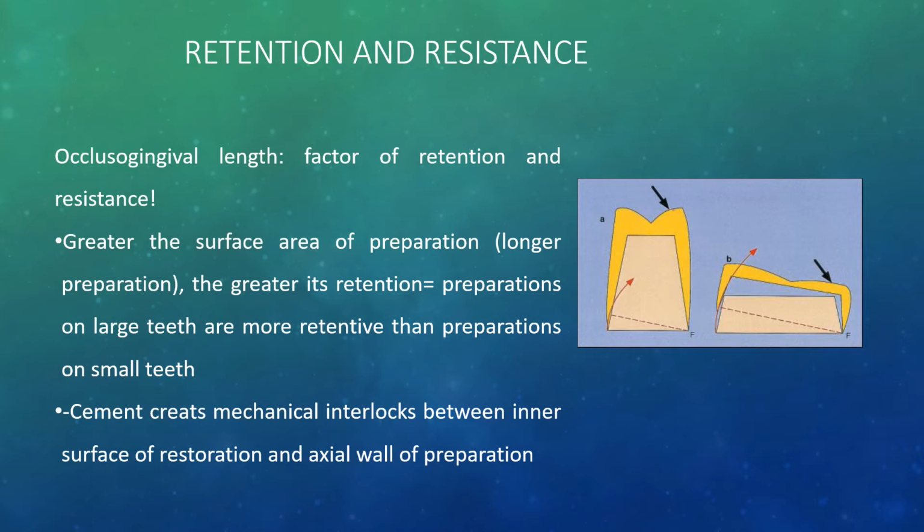Whereas if it is a molar, the retention is already compromised, and you see that the height of the tooth is very little. So this is where you will have to take a call. You have to give additional factors to substitute the retention. So you prepare additional retentive notches, or proximal boxes, proximal undercuts, so that it enhances the retention form by increasing the surface area.